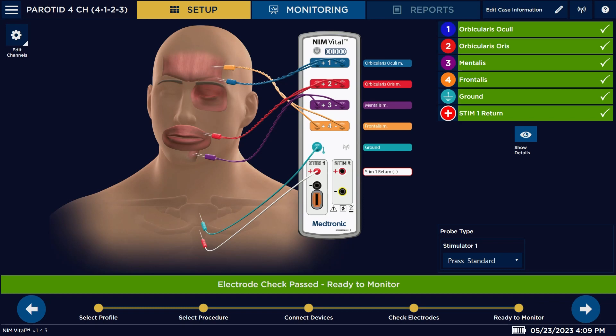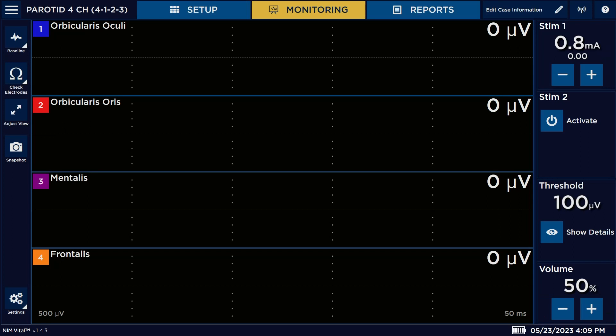So we picked this one. Now we're going to go over to our next step — we're going to hit our arrow, and now we're in our main monitoring screen that you're normally going to use to proceed with your procedure.